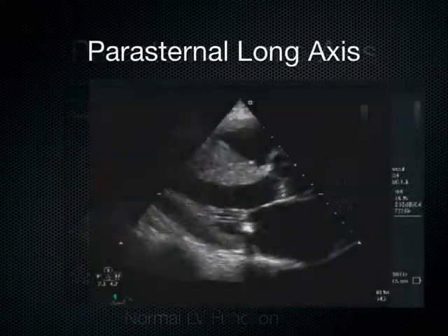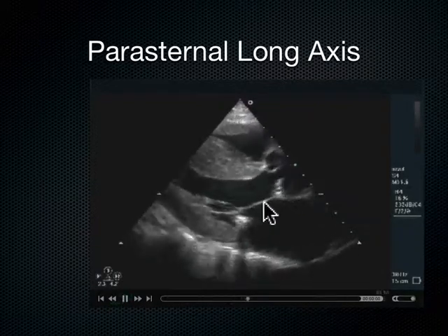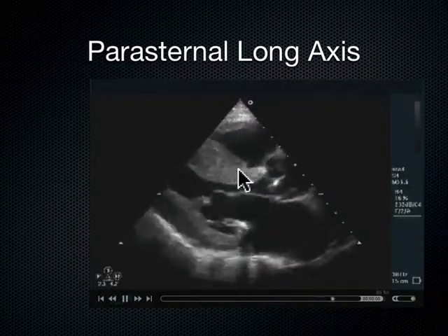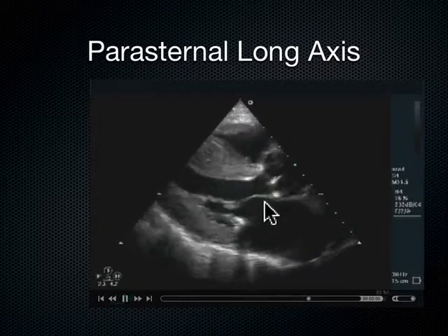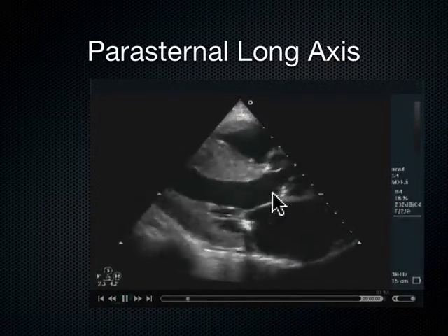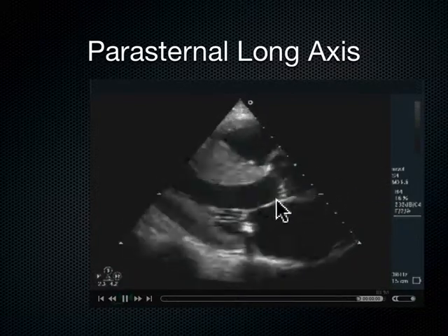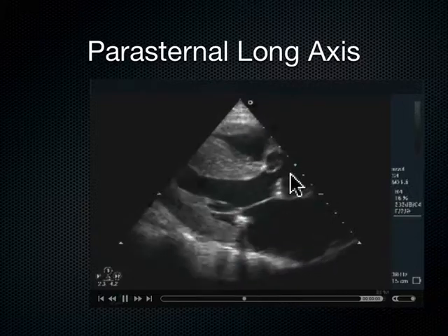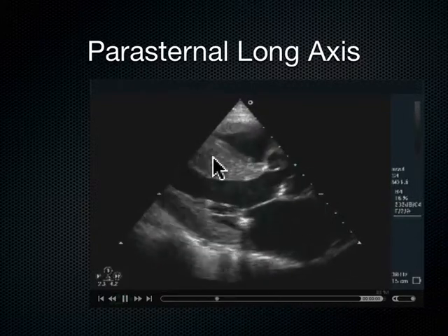Now let's look at another heart and do the same thing. How's that septal leaflet doing? Is it coming up and smacking the interventricular septum? You know what? It gets very close. It's got some good movement. I'm going to say yes. Okay? Is there sequentiality? You know, I don't think so. They seem to both kind of fire at the same time. So I don't see like one then the other. Then I'm going to move on here.